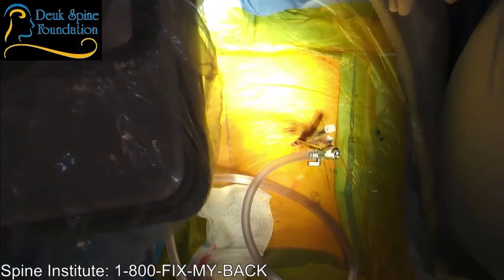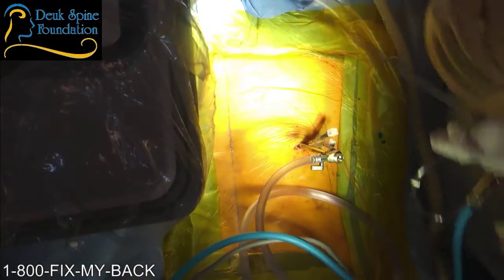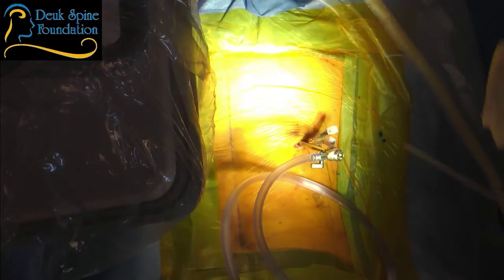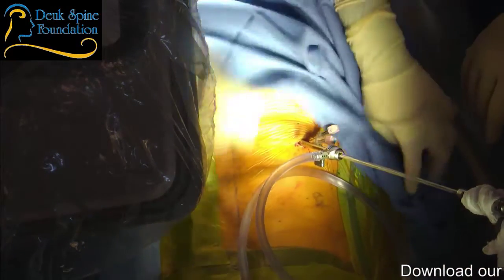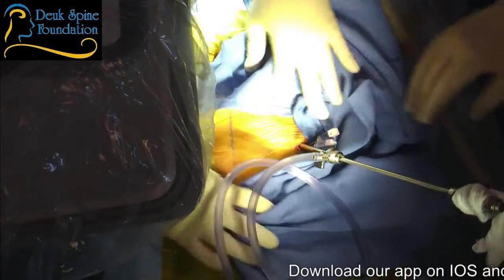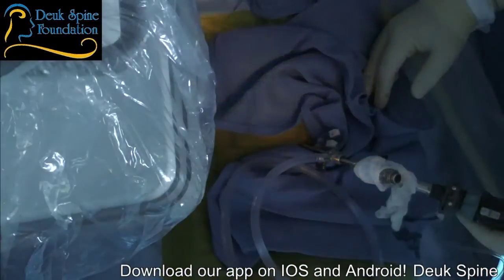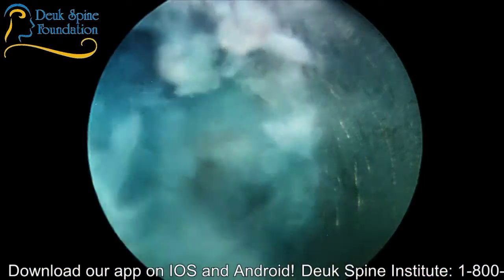All right. So, again, I'm Dr. Arjun Majan, CEO and founder of Deuk Spine Institute. We are doing a lumbar Deuk laser disc repair on a patient with 3 herniated discs, L34, L45, L5S1. She doing okay? Yeah, so, you know, she wasn't moving a lot to begin with, so I would say you could probably run her lighter. I think she was pretty well behaved.